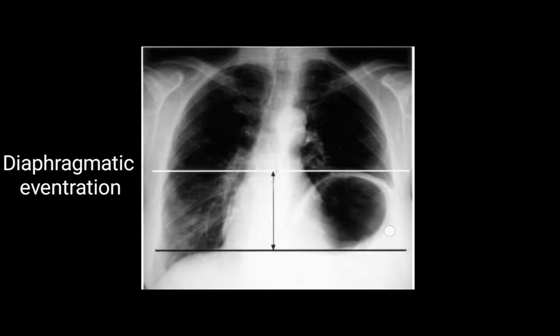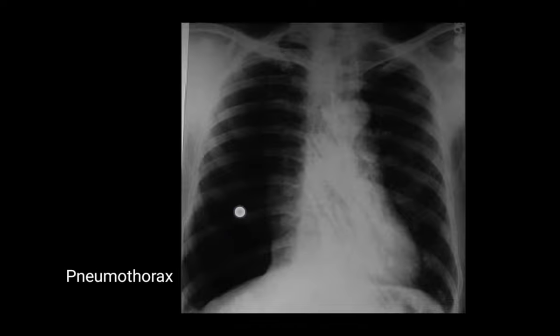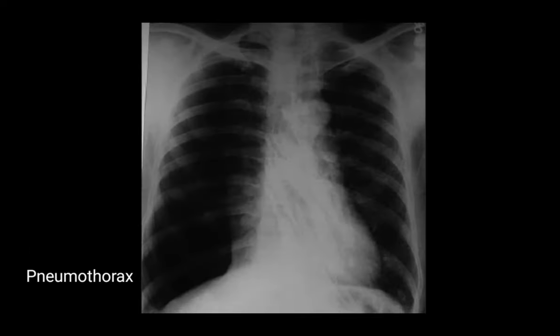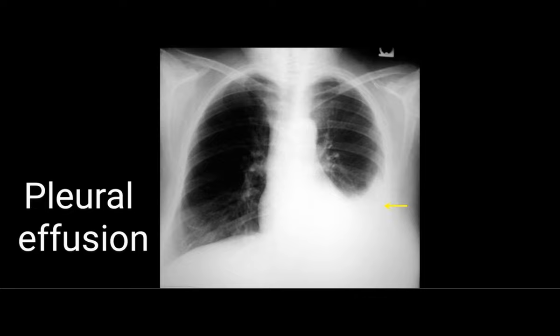This is an image of diaphragmatic eventration, where the diaphragm is pushed upward on one side. Next is an image of pneumothorax — the lungs appear more black than in other X-rays because there is air in the pleural cavity. Following that is an image of pleural effusion where the costophrenic angle is blunted.